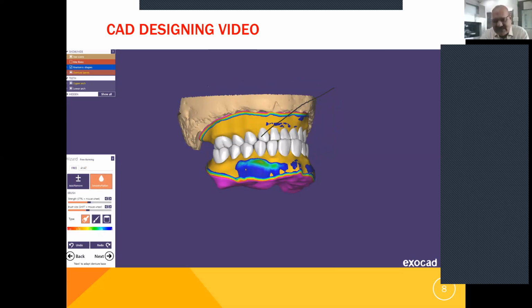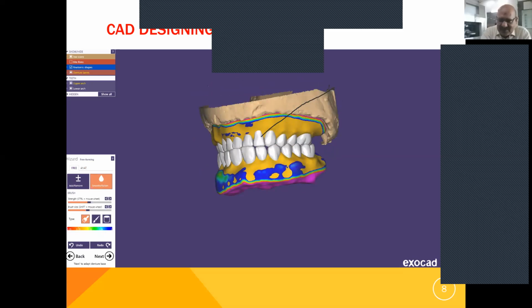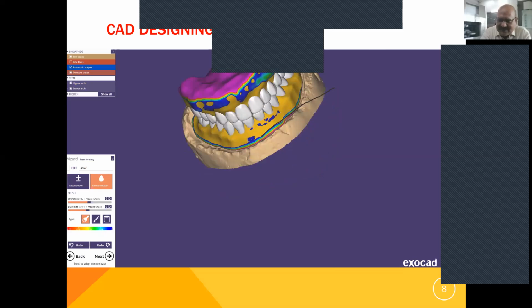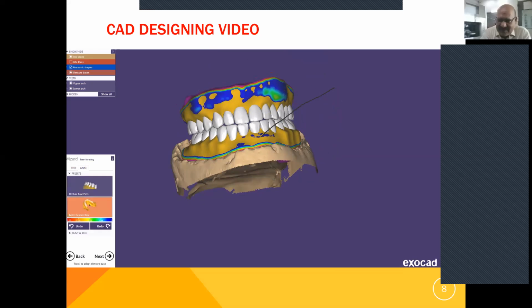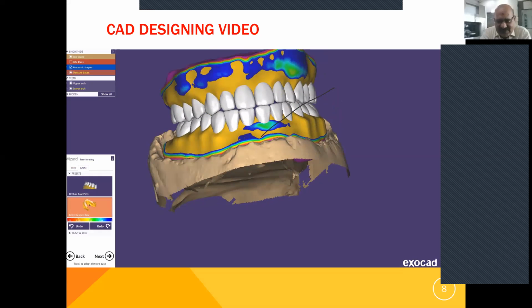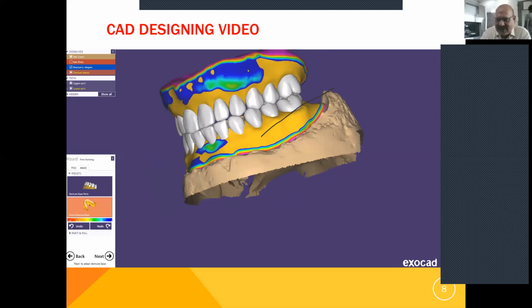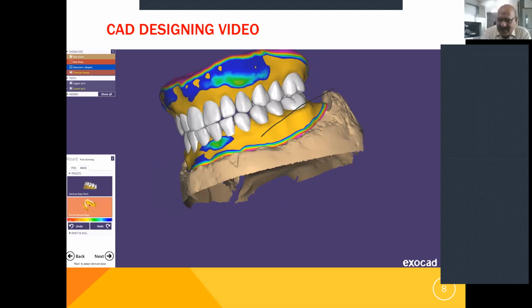The best point is that I delivered the dentures yesterday, and Dr. Swati was asking. I wish she could experience the fit of such milled dentures. By virtue of me being a Hyperdent application specialist, I can design the milling templates for dentures and fine tune like anything. So the fits are amazing and they just don't fall out easily. They have a good retention, a balance of retention and not overpressing the mucosal area.